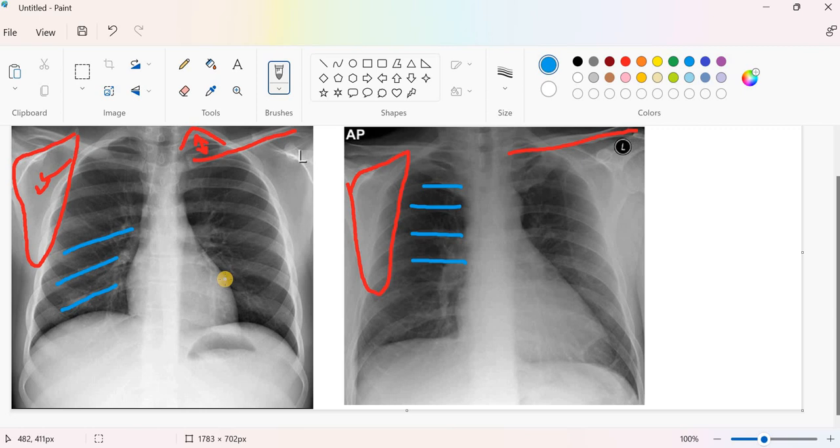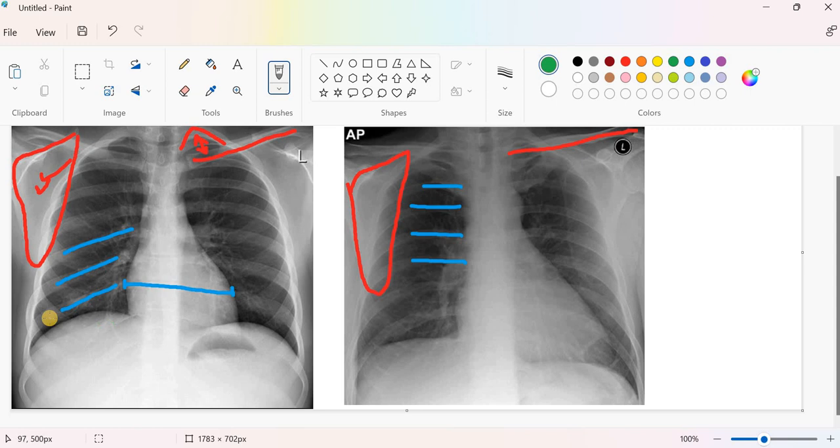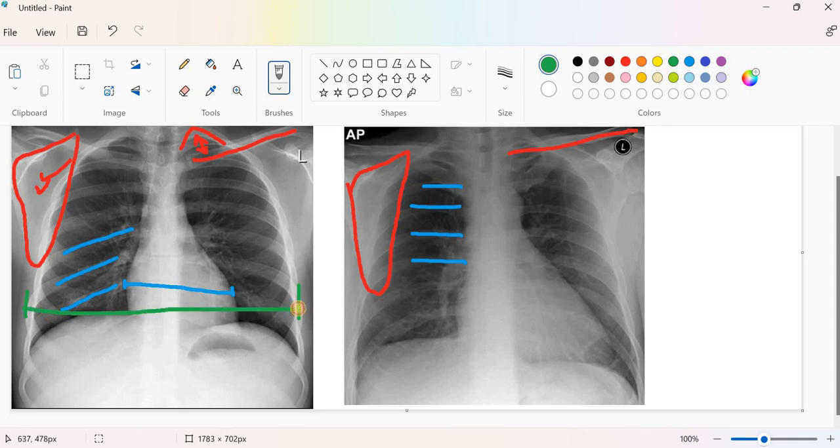How we can decide and compare the size of the heart? If you look here to the size of the heart, we are getting to the farthest points of the heart's right and left and taking a horizontal line. And then this horizontal line, if it is compared to the whole transverse thoracic diameter, the largest part between the farthest point on the bones between the ribs, if you compare this to that, it shouldn't exceed 50 percent.